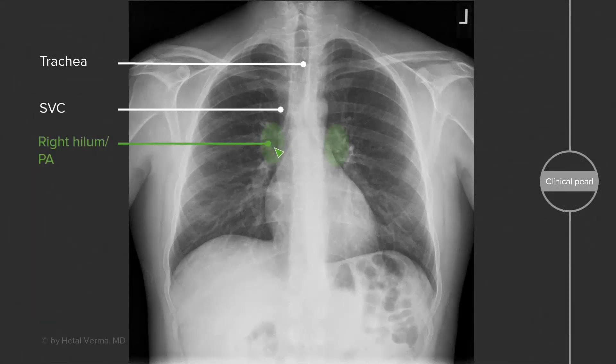We want to take a look at the hilum to look for any kind of hilar abnormalities. It's a very common place to have a mass or lymphadenopathy, and each of those green circles represents the hilum on each side. The pulmonary artery is also located in this region.